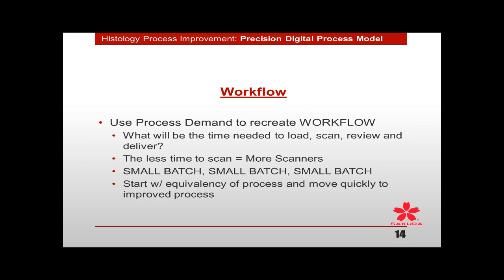And when you're setting up your process, you want to start with equivalency. You want to make sure that your digital scanning is equal to what most people will say is the gold standard, which is the glass slide. But I'm saying you want to move quickly to an improved process. Is it really going to be acceptable that we have the same quality, the same capability, the same integration of information that we had with a glass slide and then stick it in this digital? I don't think so. I think we have to start with that and then quickly move to what our improved process is and where we're actually going to see big gains in this.